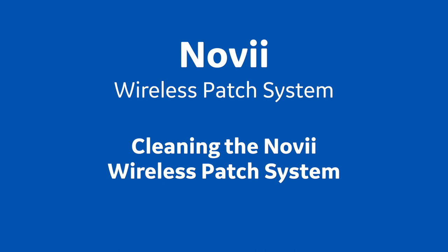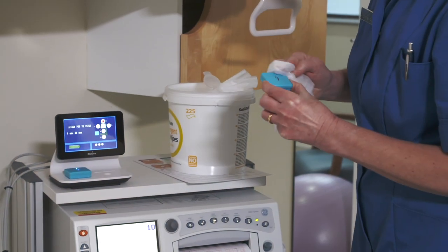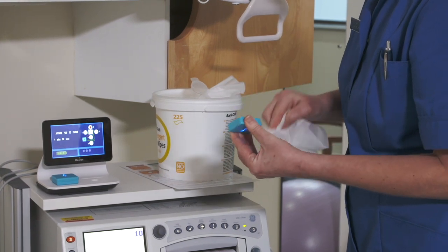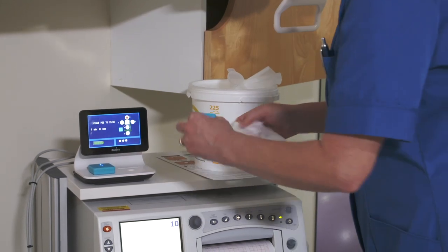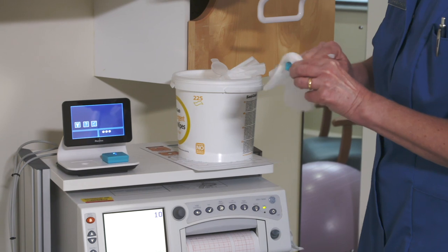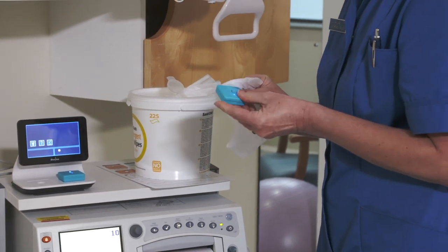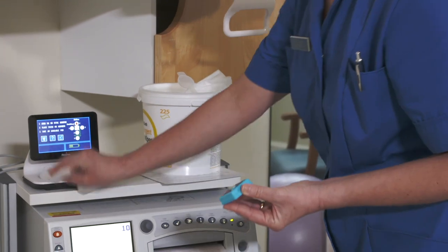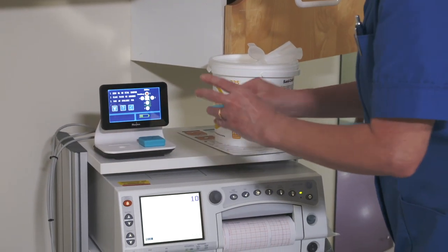Training Session 10: Cleaning. Wipe the Novi interface, Novi pod, and interface cables with a soft, non-abrasive cloth or disposable wipe soaked in aqueous detergent or disinfectant, or other solution such as 70% isopropyl alcohol. It is then good practice to use sterile or distilled water to remove the cleaning solution residue before drying thoroughly with a sterile soft towel or gauze surgical sponge.